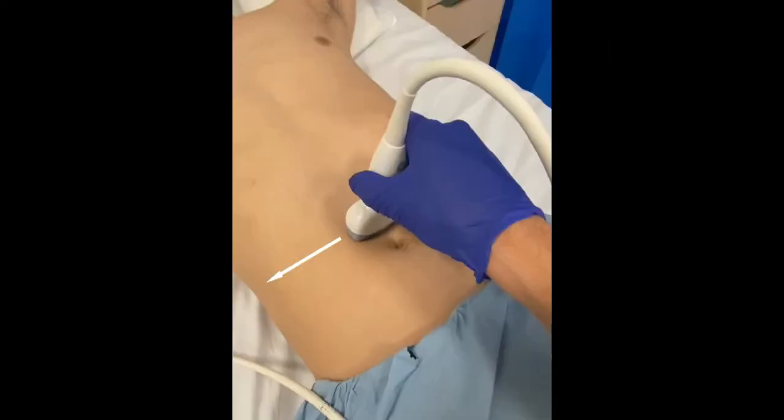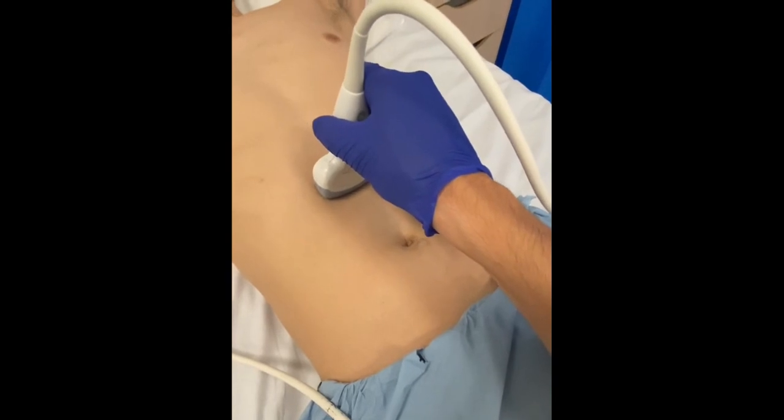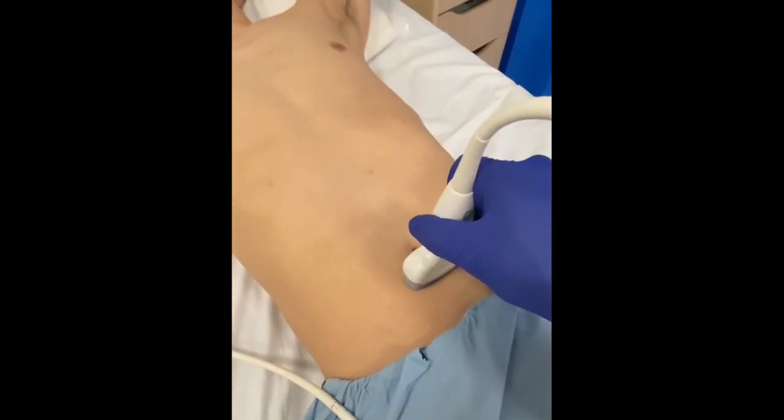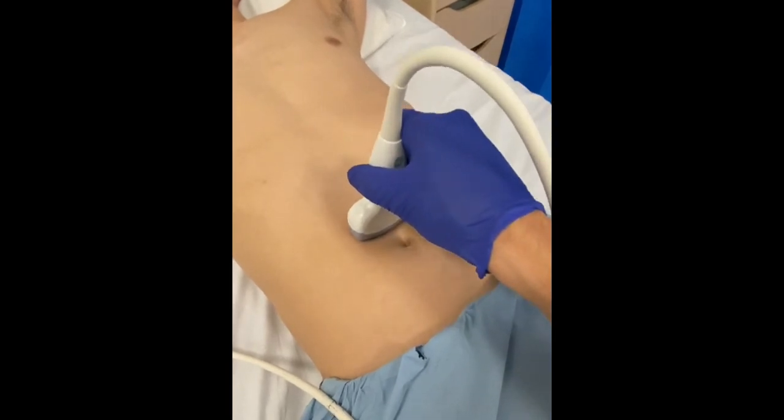So here we can see the probe placed on the abdomen with the probe marker towards the patient's right side, and the probe is just moved superiorly and inferiorly to cover the distance between the proximal aorta down to the bifurcation of the aorta. It doesn't matter too much particularly where you start the scan, as long as you make sure to take all the measurements as we've mentioned.